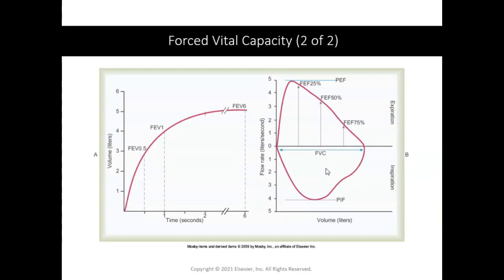So this is what that maneuver looks like on your screen. This is your volume time scalar. What I'm looking for on this typically is that my patient's forced expiratory maneuver starts right here at 0 seconds. If this curve starts further out like this and then goes up, this is called an extrapolation. Okay, this area here, and that also invalidates your results.